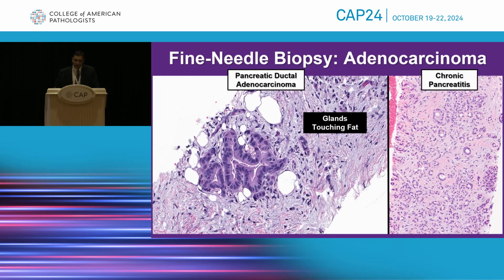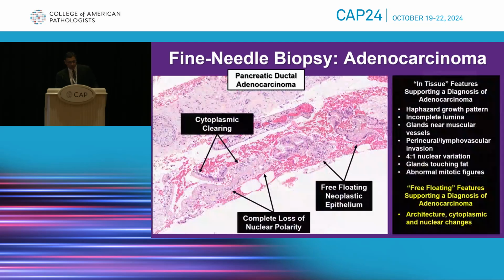Certainly as we age, our pancreas becomes fatty, especially in the tail of the pancreas and then later into the body. But the normal ducts should also undergo atrophy and eventually die off along with the acinar parenchyma. In contrast, adenocarcinoma is really resistant to programmed cell death and often invades the surrounding adipose tissue.